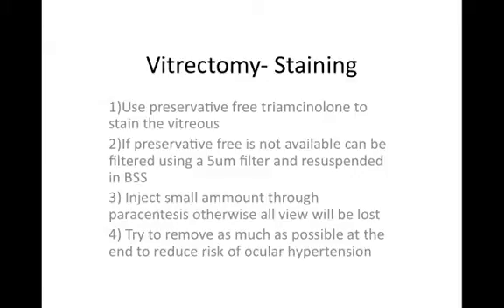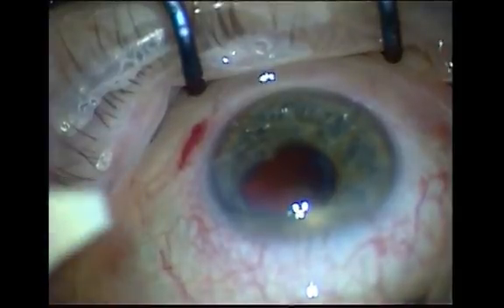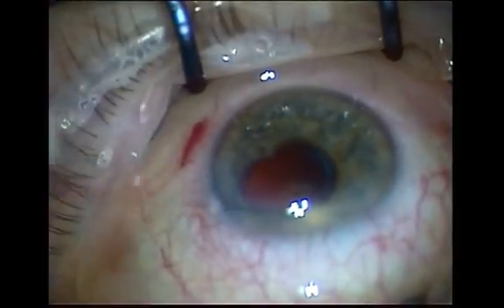However, do not do it as in this video, but rather avoid any traction on the vitreous, as this may be transmitted to the retina.